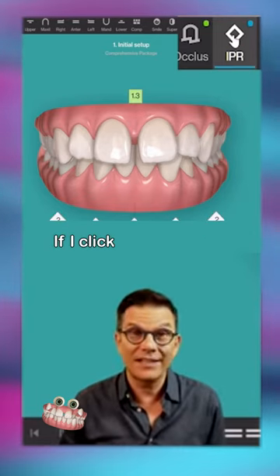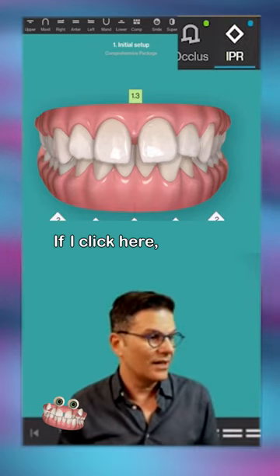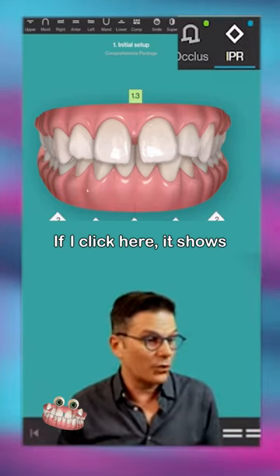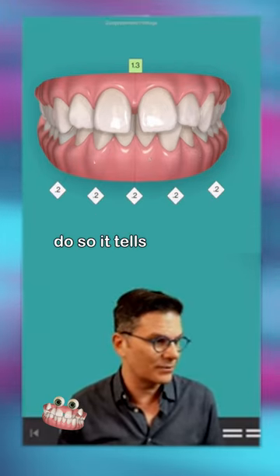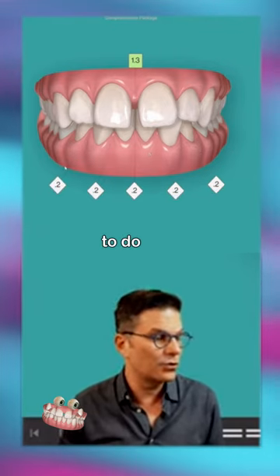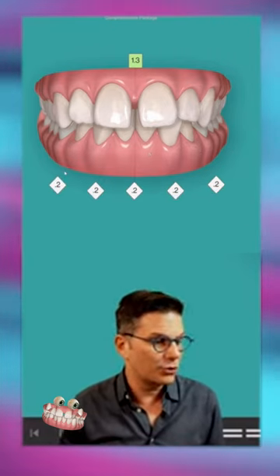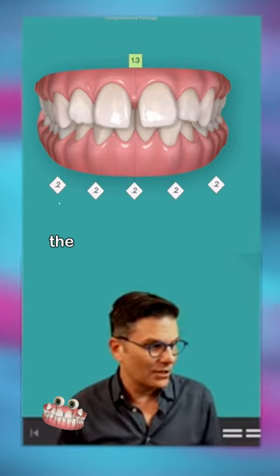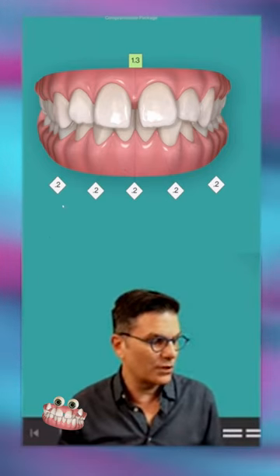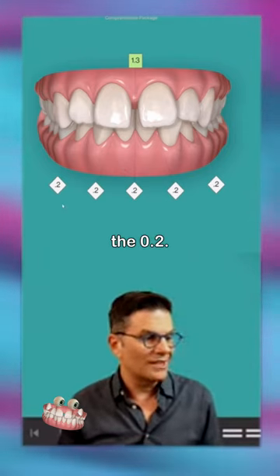If I click here, it shows me the IPR I need to do. It tells me I need to do 0.2 millimeters of IPR. You see the white diamond here with the 0.2.